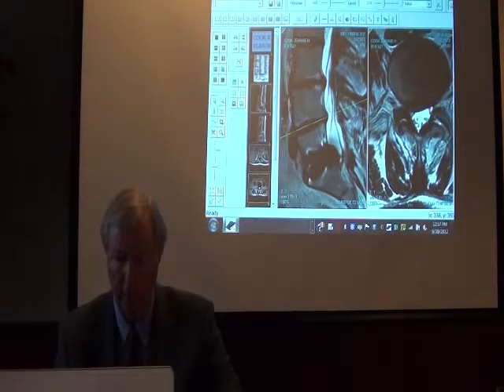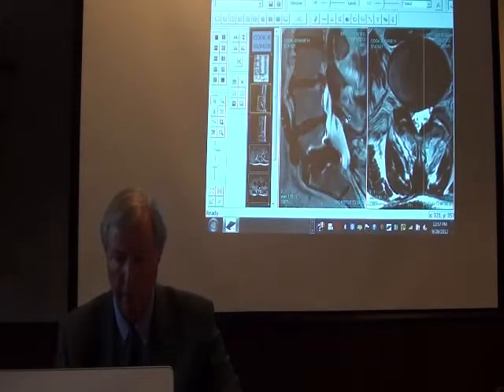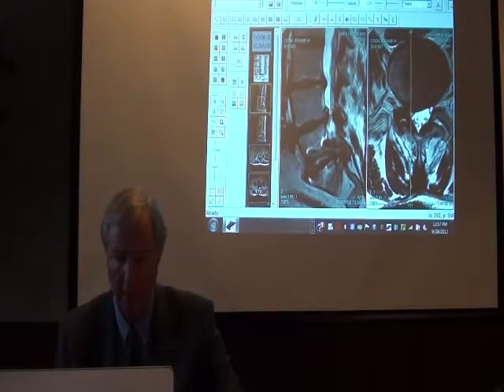And if we go over to the mid-sagittal section, you actually see it right here. So this is disc material that has actually squirted out of the disc. It's right up here. It's putting pressure against the nerve roots on the right, which would be the L4 nerve root and the L5 nerve root on the right side.